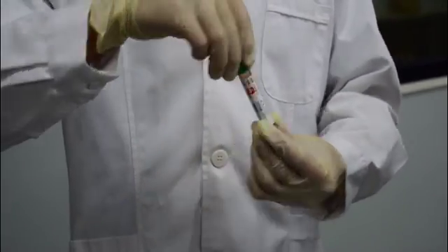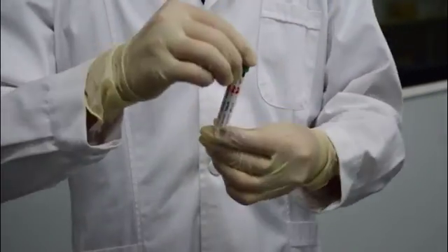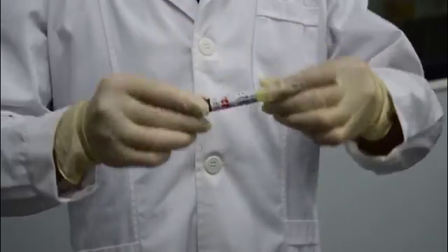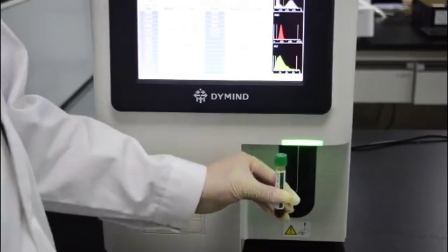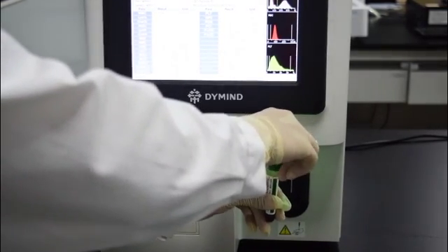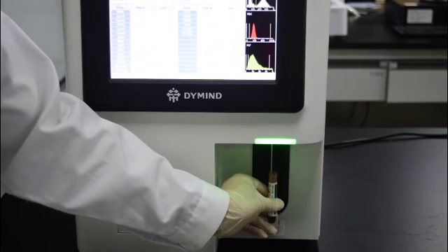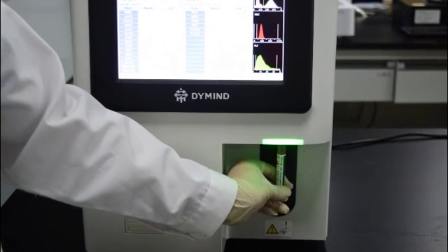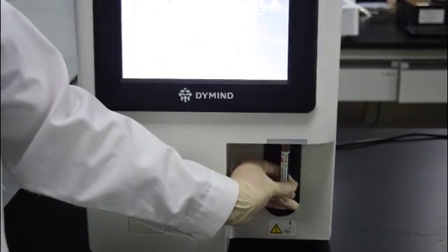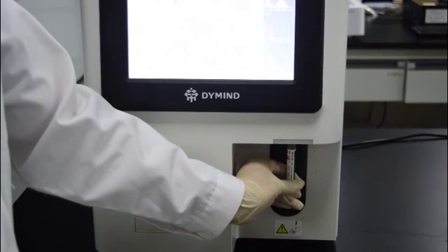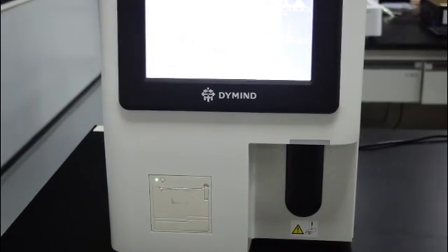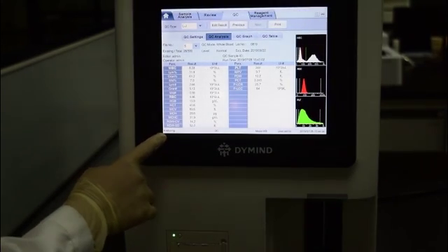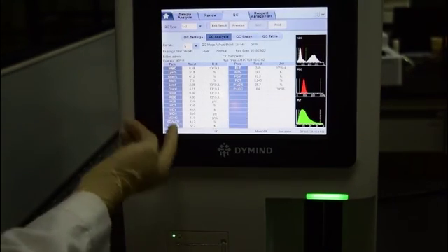Mix controls well. Aspirate controls. To ensure reliable analysis results, please conduct this daily QC test and check if it is out of range before running blood samples.